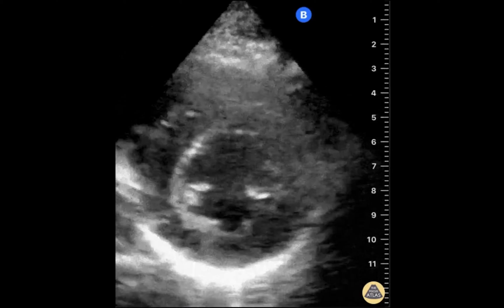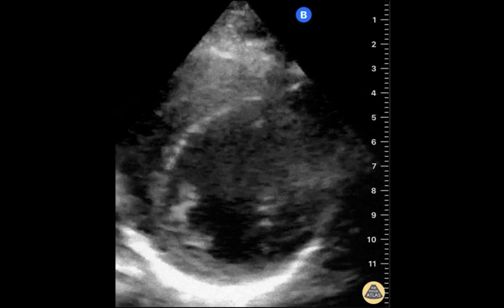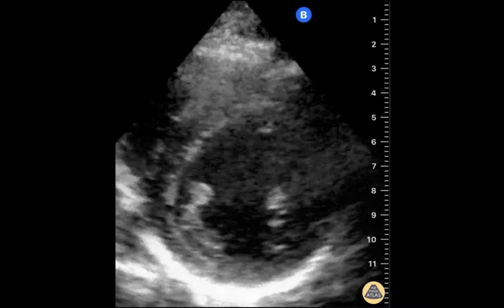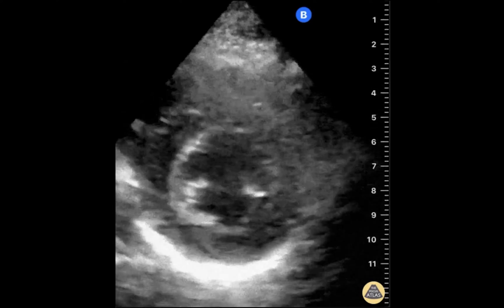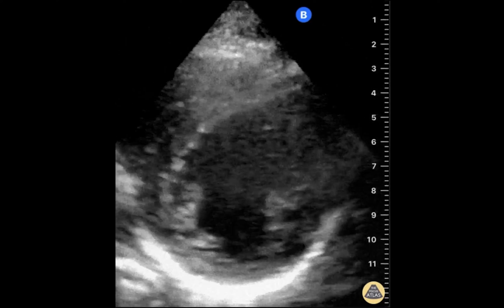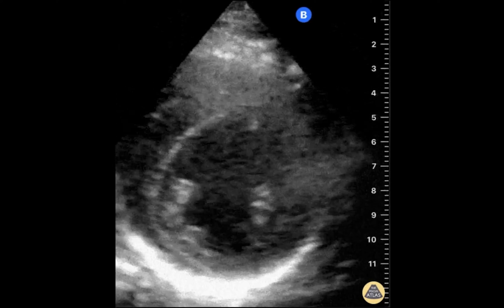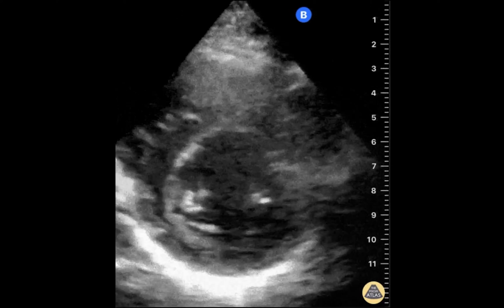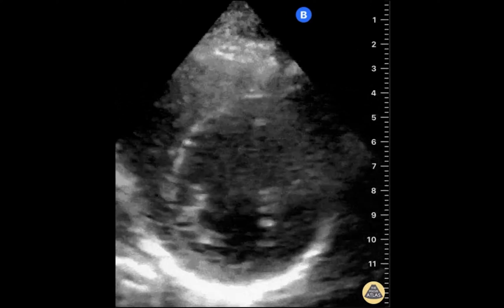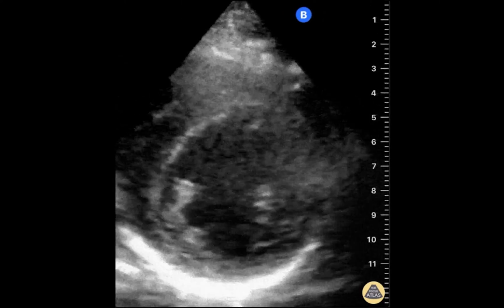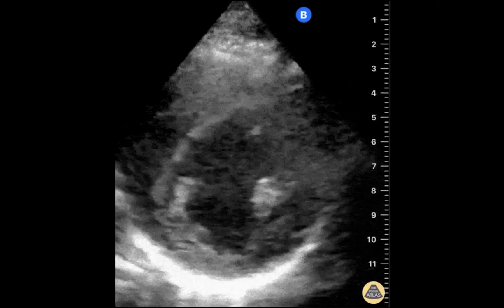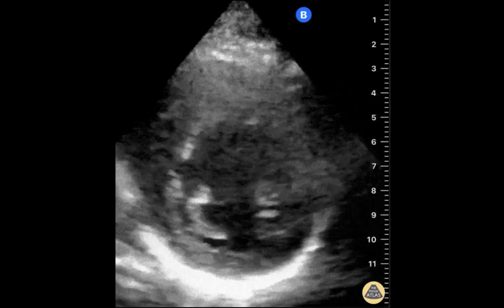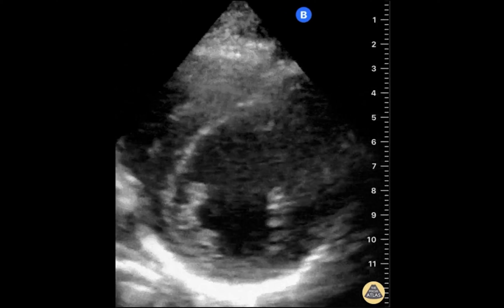The goal of this view is to place the imaging plane perfectly perpendicular to the long axis of the heart, approximately halfway between the level of the valves and the apex of the left ventricle. You'll know you have the correct view when you can see the two papillary muscles side by side within the left ventricular chamber. You should not be able to see any part of the mitral valve from this position.